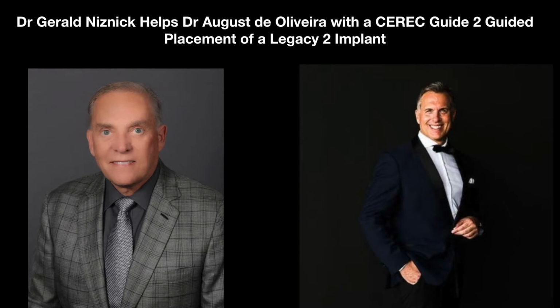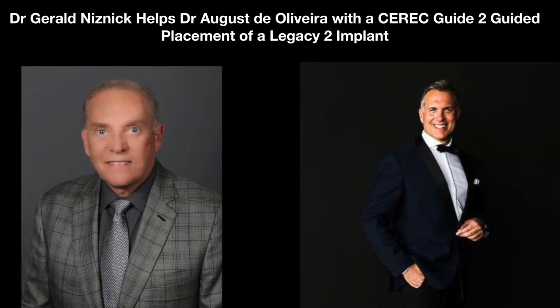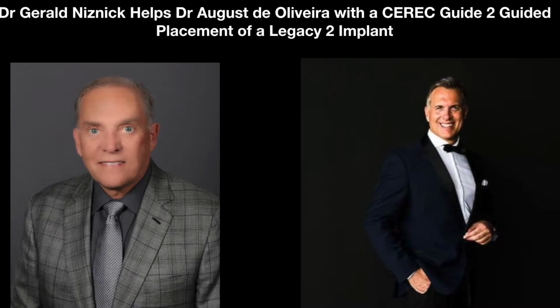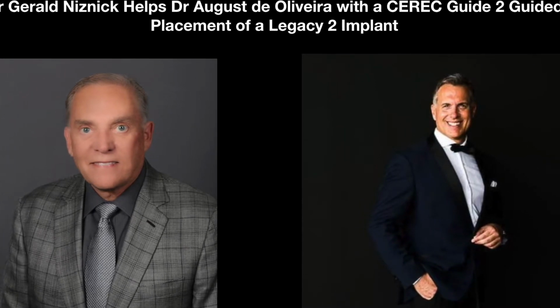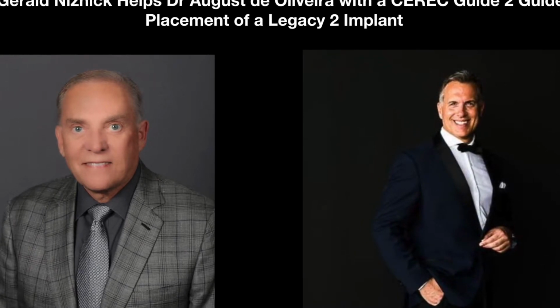Hello everyone, this is Dr. August de Oliveira. In this video, Dr. Gerald Nisnik, the godfather of modern implantology, will assist me in placing a CIRAC Guide 2 surgical guided case where we place a Legacy 2 implant on one of his relatives.